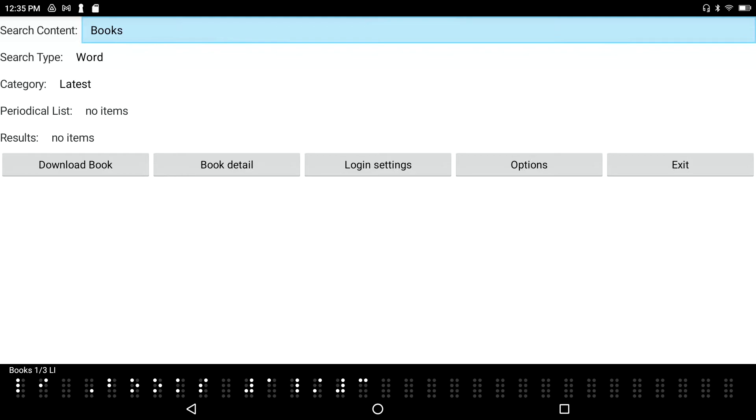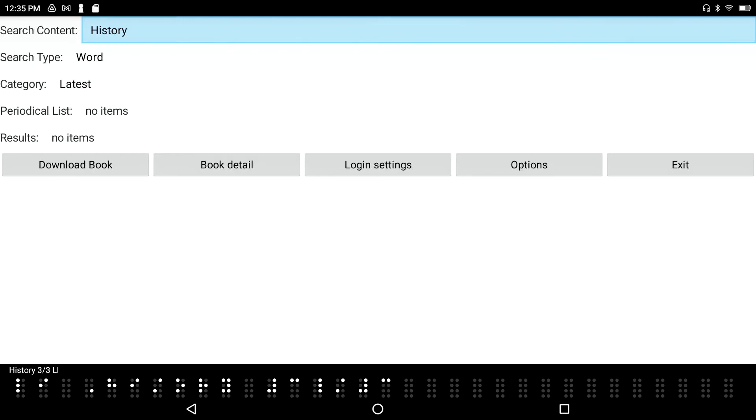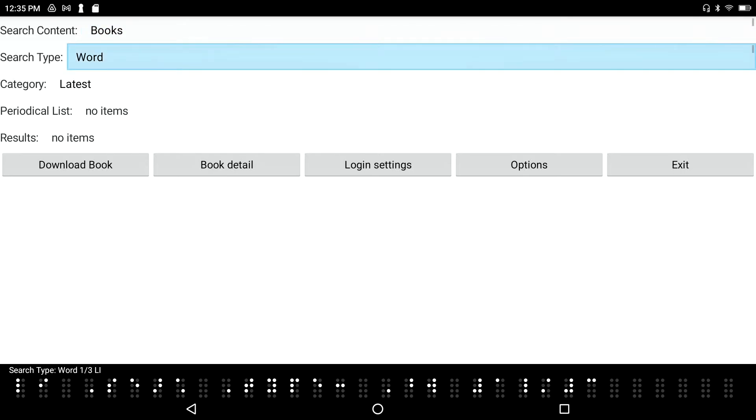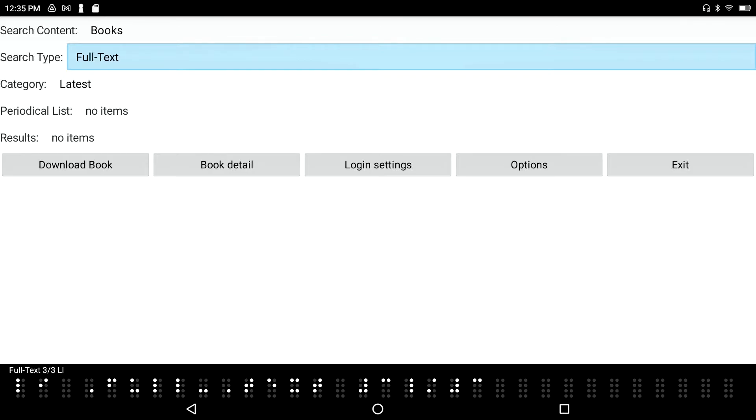I've got login success, which is lovely. If I down arrow through the choices in this list, I've got books, periodicals, and history. Let's go back up to books, and I'm going to tab. Search type - my choices here are category, full text, and word. I'm going to go back up to word.